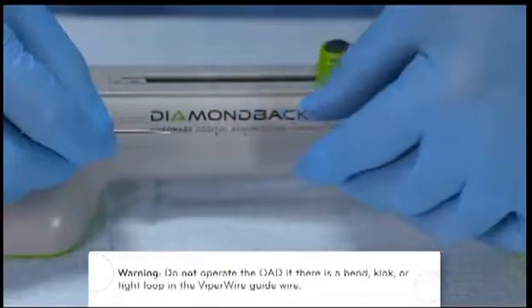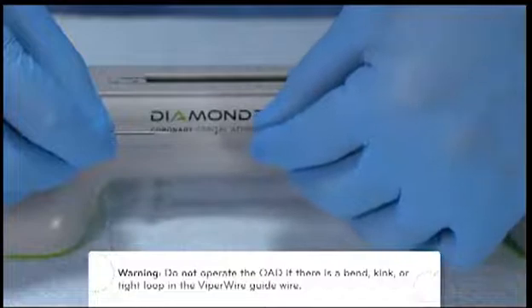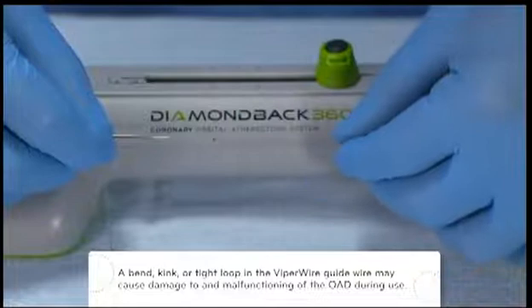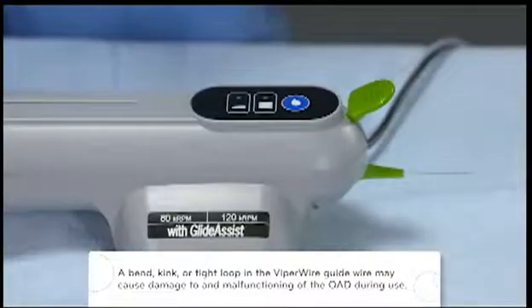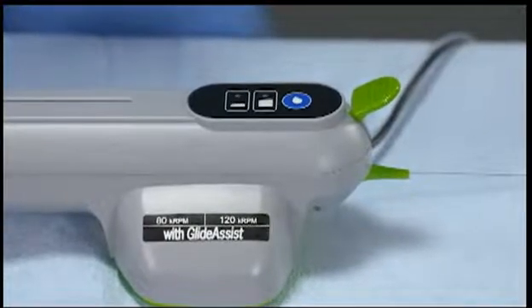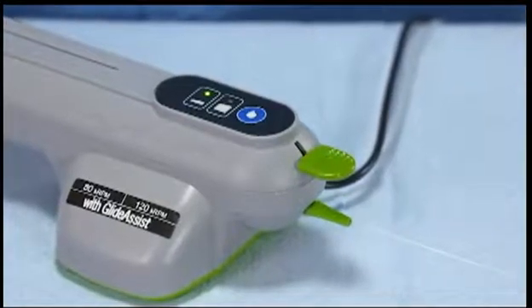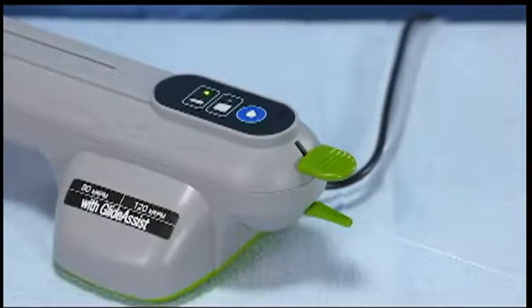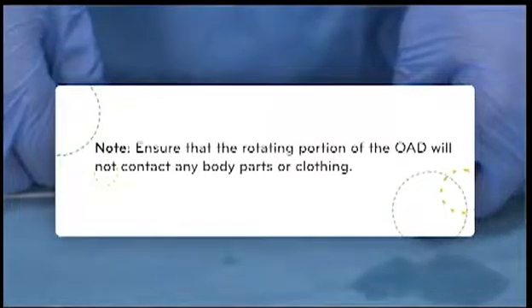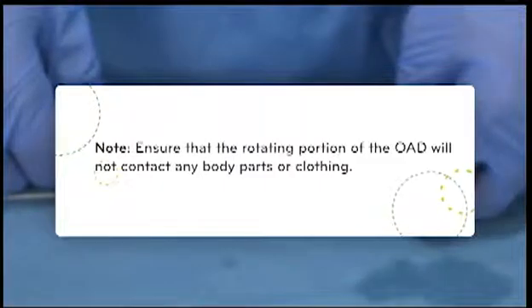Grasp the proximal end of the guide wire and thread it through the hole in the shaft tip, distal to the crown. Continue feeding the guide wire into the shaft until the guide wire appears at the rear of the handle. The OAD should not have passed through the hemostasis valve at this point. Ensure that the brake is locked, as the crown will not spin if the brake is open. Verify that saline is still flowing freely and check the saline tubing and connections for any leaks. Ensure that the rotating portion of the OAD will not contact any body parts or clothing.